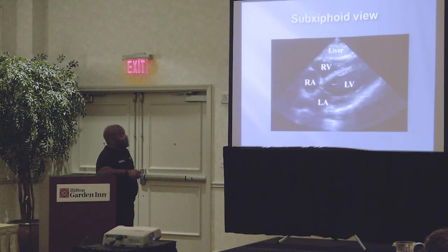And you say to yourself, well, self, I wonder how big this PE is, because they really look crappy. And the blood pressure is 100 systolic. You plop the ultrasound on here, and what you see is a huge right ventricle, a tiny left ventricle, and this bad boy here is coming like this into the left ventricle. That's called bowing, the bowing of the septum. So this is nice and flat right now.